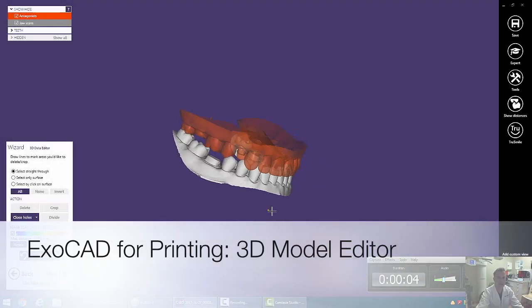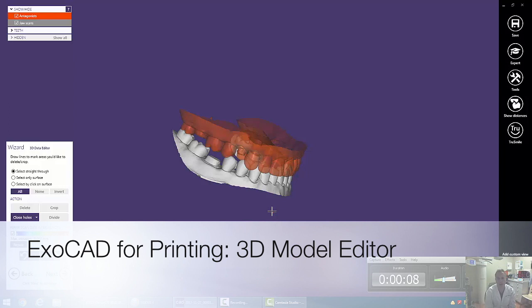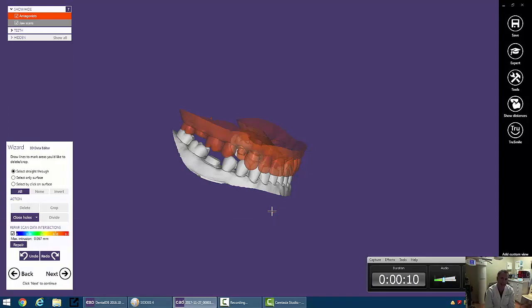All right, welcome back. Video number three. In this, we're going to cover the 3D data editor of ExoCAD.